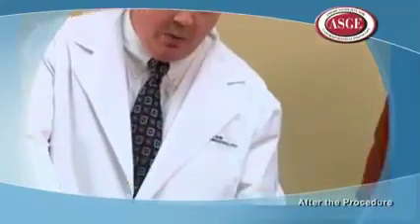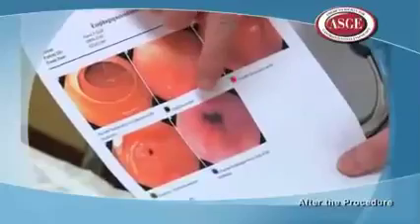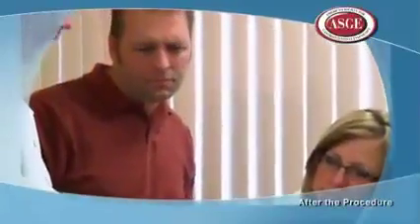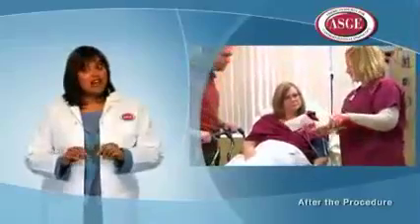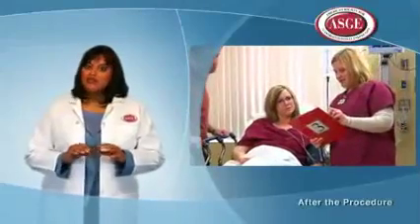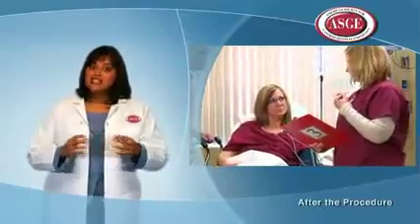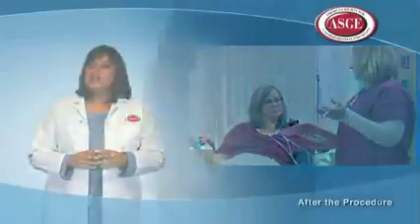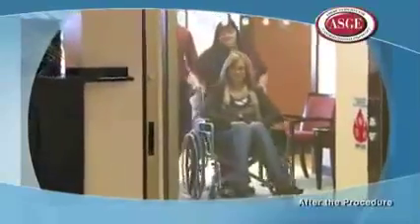It's quite common to have tissue samples taken during the test. This does not necessarily mean that anything is wrong. Any tissue removed will be sent to a doctor called a pathologist. This doctor will look at the tissue under a microscope. These results will not be ready right away and generally take several days to be completed. Before leaving the doctor's office, a member of the endoscopy team will suggest how best to check on those results. You will also receive instructions for what to do once you arrive back safely at home.